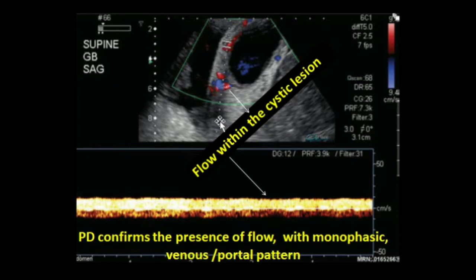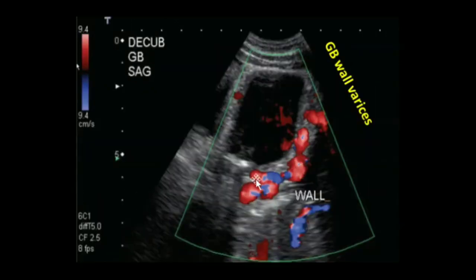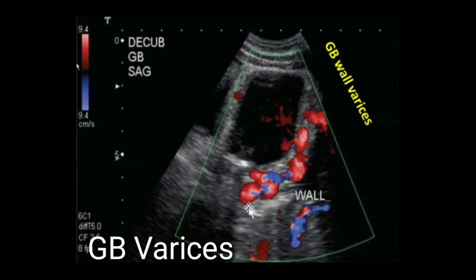By applying pulse Doppler it was confirmed that the flow is monophasic with a venous or portal pattern. This image also shows the presence of blood flow in the cystic lesions. The most important differential diagnosis of the gallbladder lesions is with gallbladder wall carcinoma.